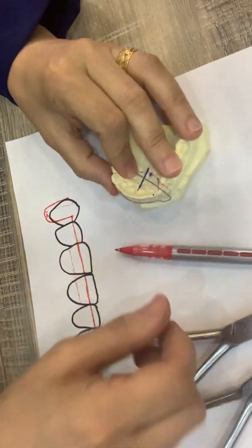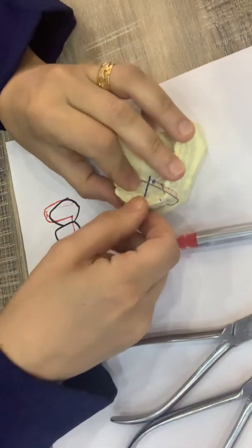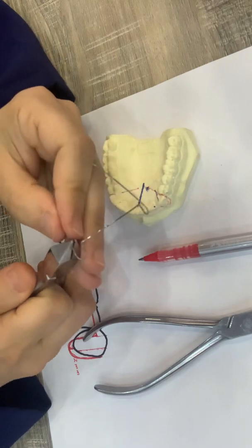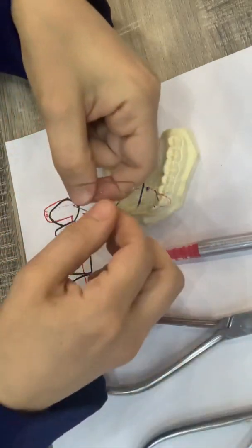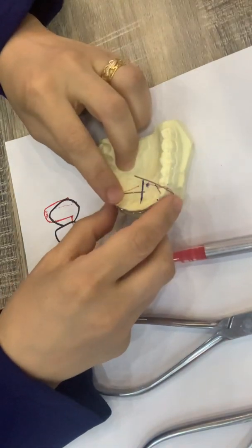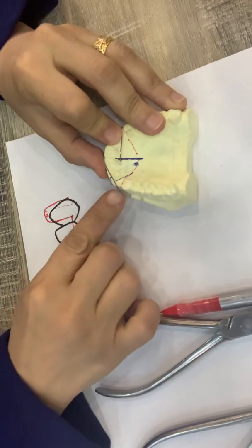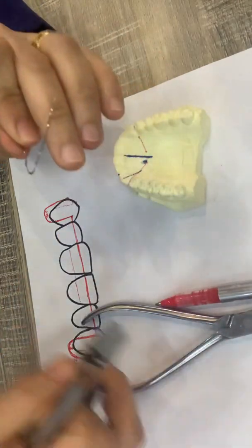Now we start with the occlusal part. Make a bend for the occlusal part. And on the other side, we need to bend the wire toward the contact area.